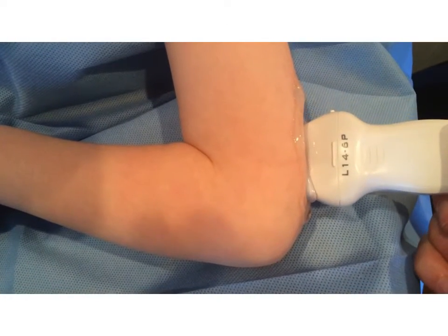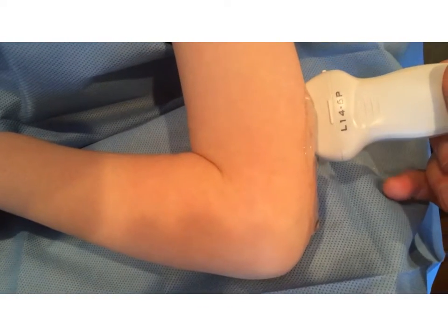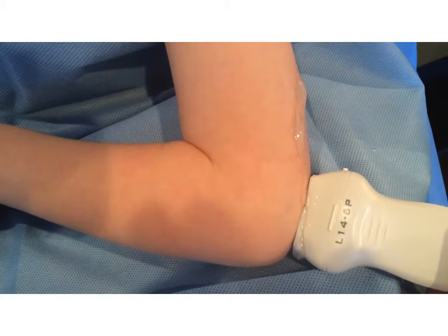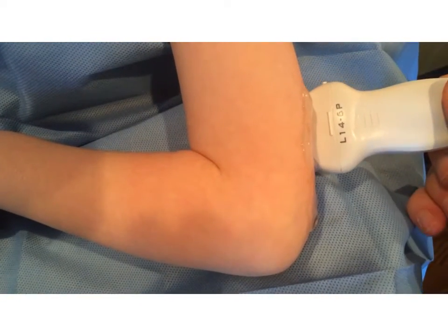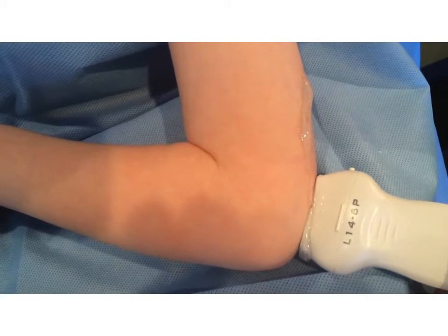This is the maneuver you will be performing in real time. Of note, you can stabilize your hand against another part of the patient's arm if required and if it's not too painful. Now let's look at the area of interest on the screen and then we will put the two pieces together.